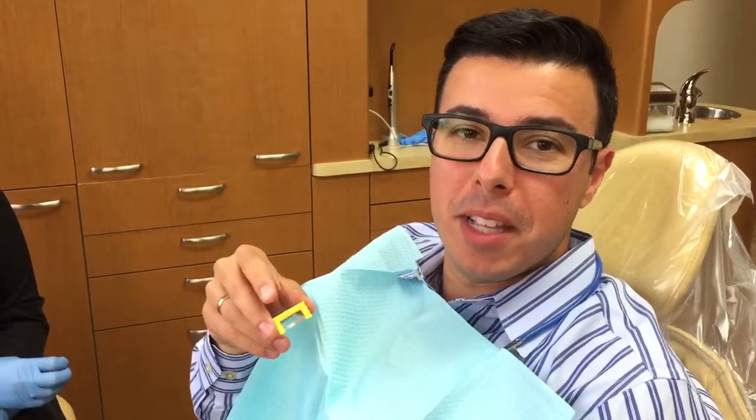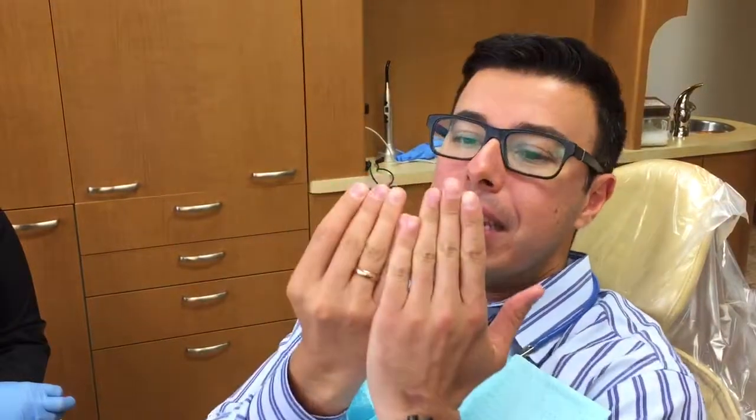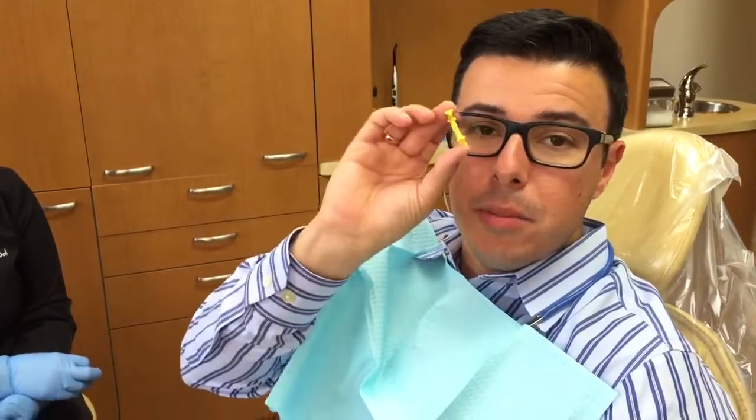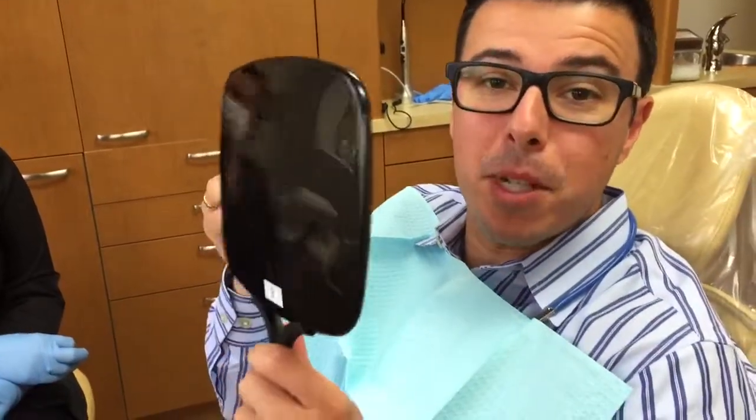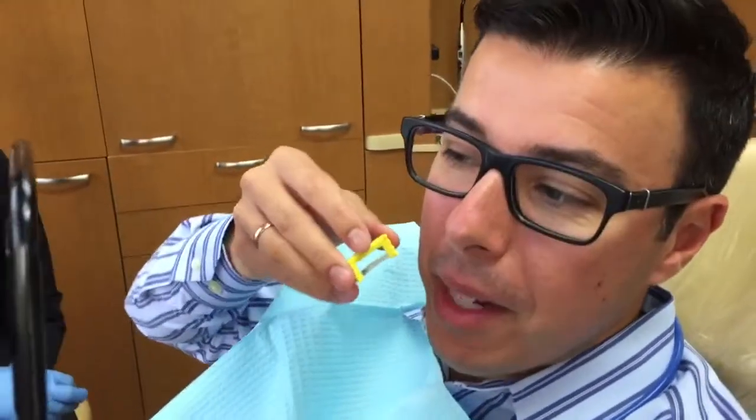I'm progressing my Invisalign treatment and today what we're gonna do is take out the friction in between the teeth so the teeth can slide past each other. We use an abrasive flossing system — little colored instruments like this — and I'm gonna show you how easy it is. I'm gonna do it on myself with a mirror over here. Rebecca's gonna supervise.